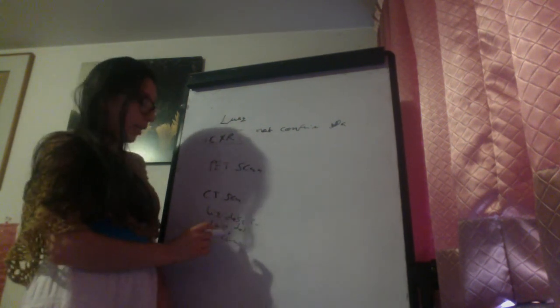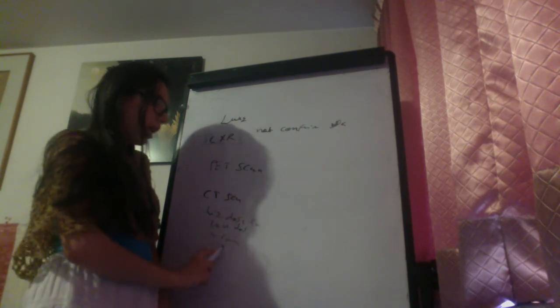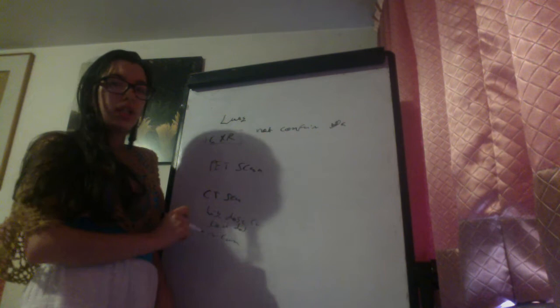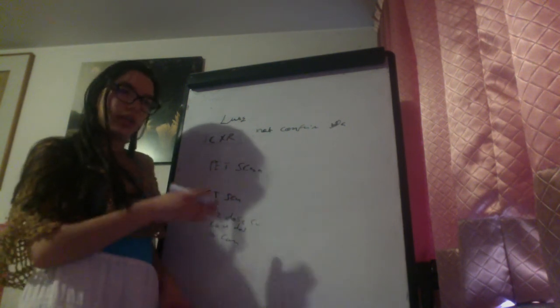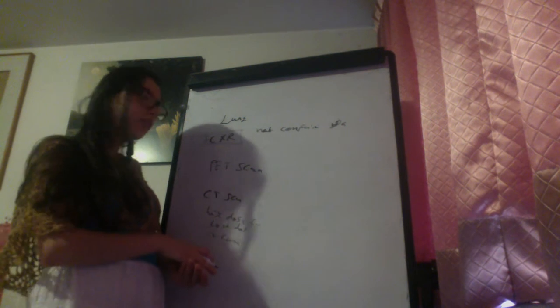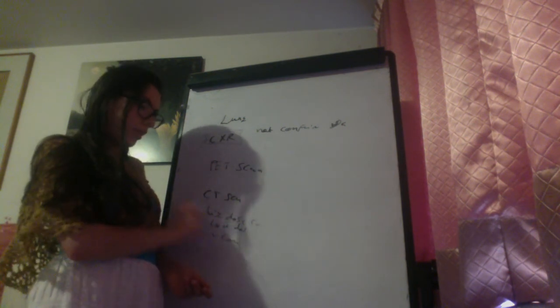The no contrast is, for example, a high resolution CT scan that does not have contrast, and a high resolution CT scan is high resolution because the slices of the imaging are smaller, so it has more slices, and we have more definition of the lesions that we can see.